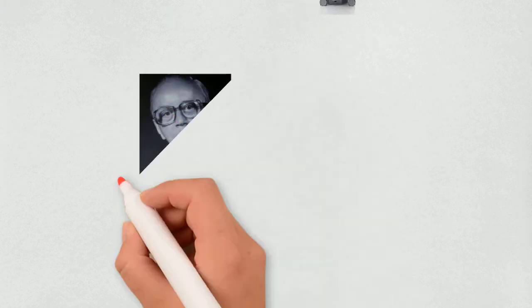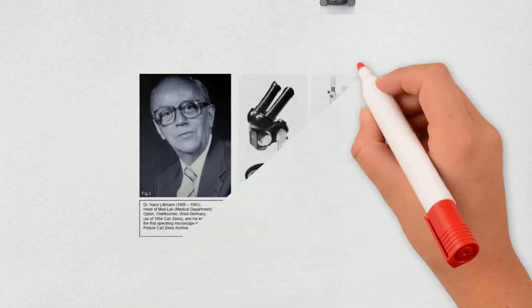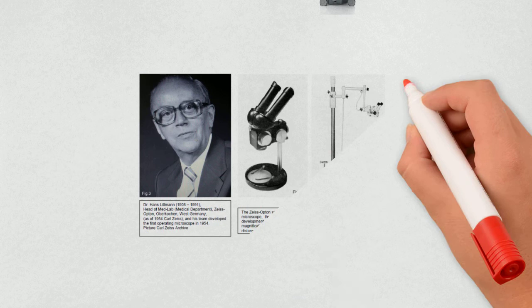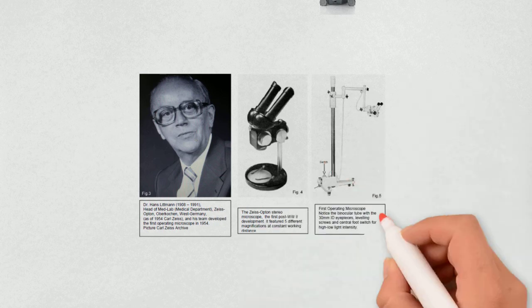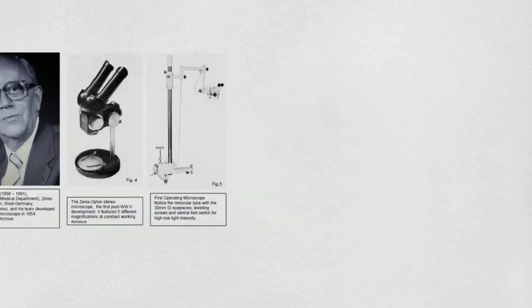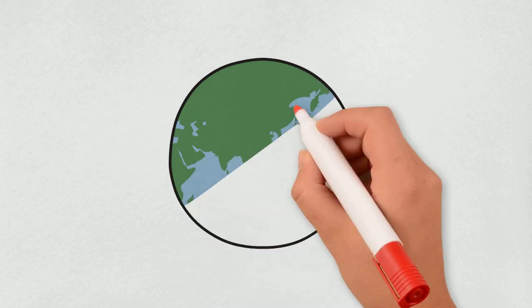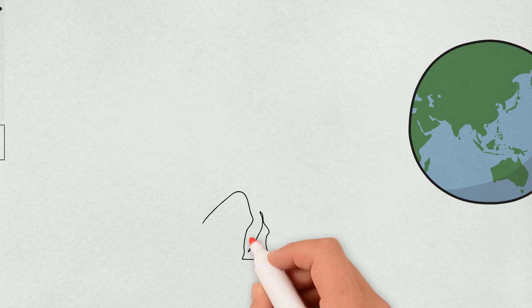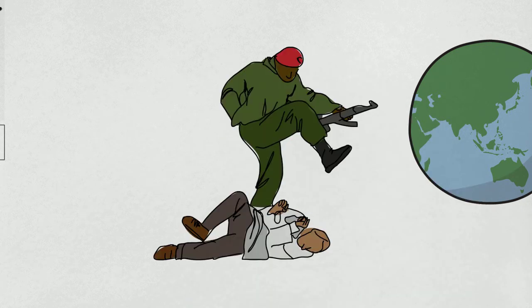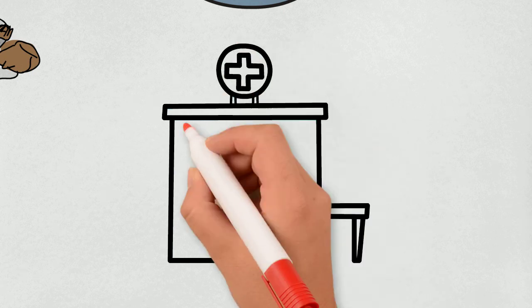The first person to use a microscope for surgery was the Norwegian otolaryngologist Carl Olof Nylen, who adapted a monocular microscope in 1922 for inner ear surgery. Shortly thereafter, he switched to a binocular stereo microscope. After World War II, ophthalmologists and vascular and plastic surgeons began using the microscope in the operating room, making further technical improvements.